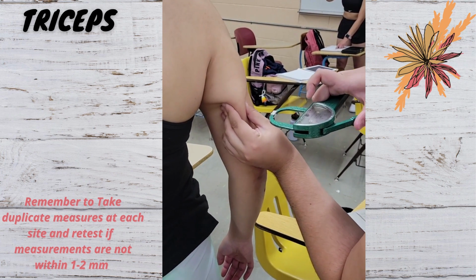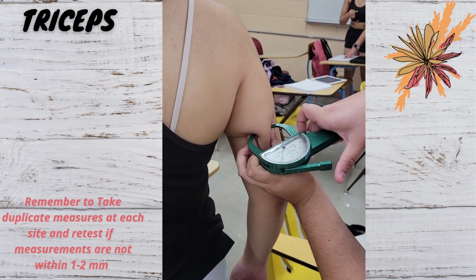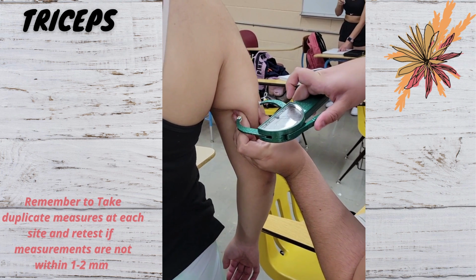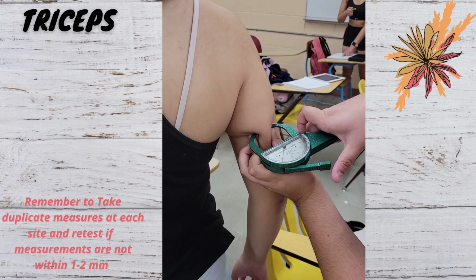When taking the right side triceps measurement, you're going to pinch a vertical fold halfway between the shoulder and the elbow. Use the skinfold calipers and remember to be perpendicular to the vertical fold. Pinch and hold 1 to 2 seconds and then record the measurement from the caliper.